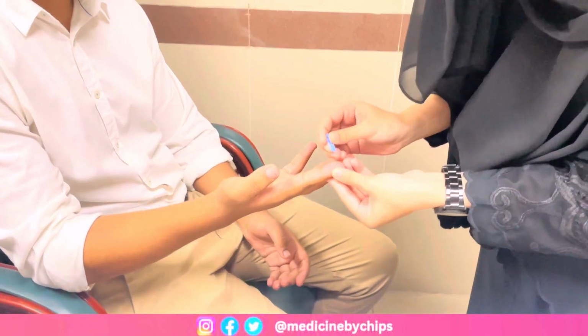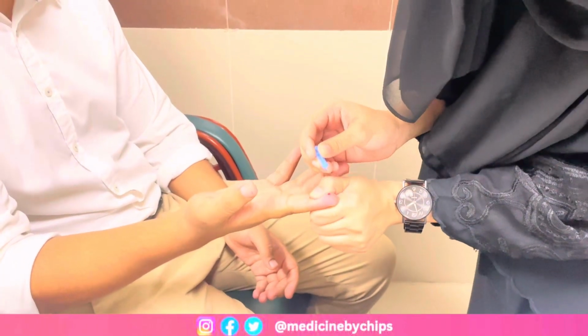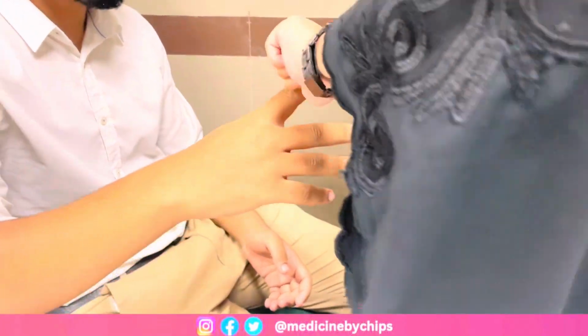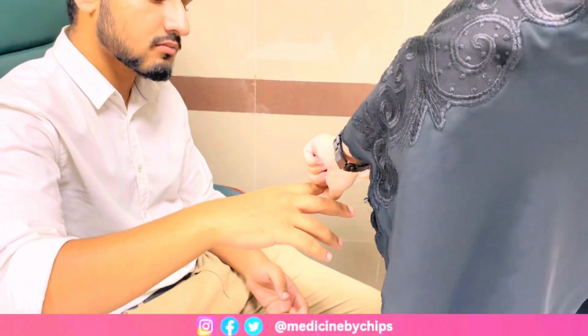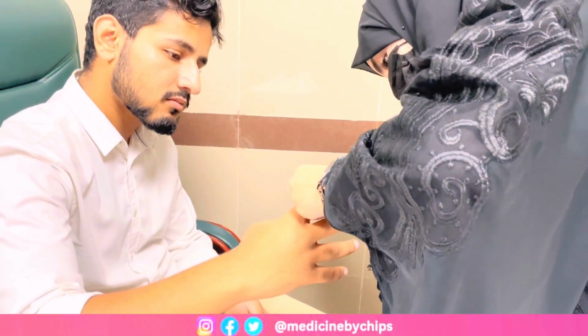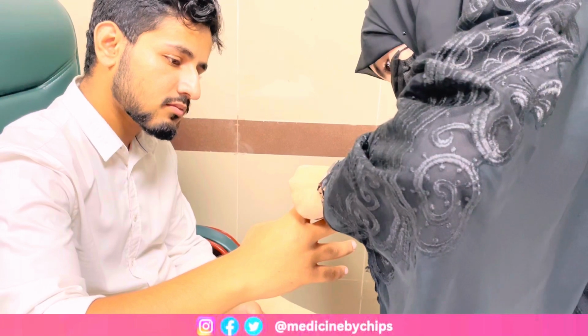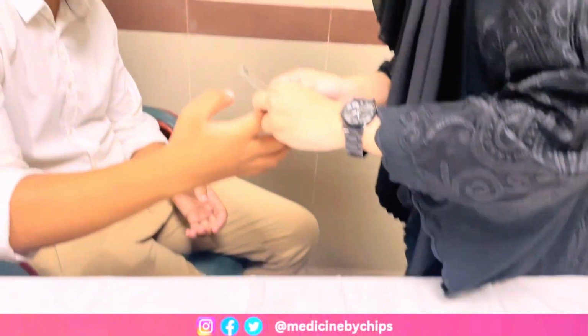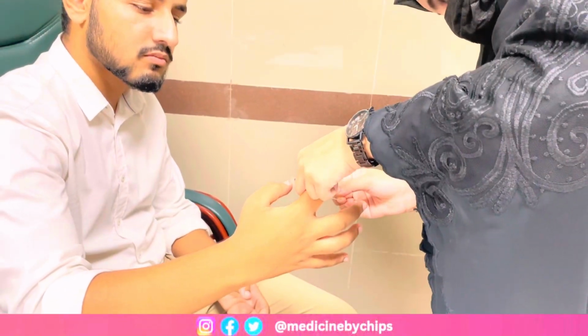Now we are going to take a pricker and slightly prick the finger. Okay, so first of all, we'll need 2 drops, one on the slide for A, and the other one for slide B. And next, we'll need 1 drop for this RH side. Okay, so we are done.